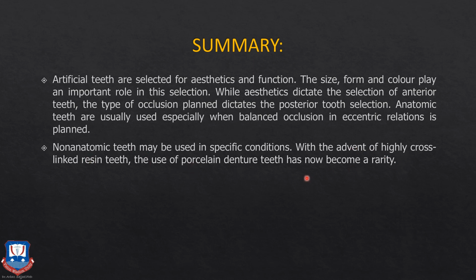With the advent of highly cross-linked resin teeth, the use of porcelain dental teeth has now become a rarity. We never see porcelain teeth being used nowadays. Most of the time we are just using acrylic teeth or high impact resin acrylic teeth, or IPN, that is interpenetrating polymer network teeth.